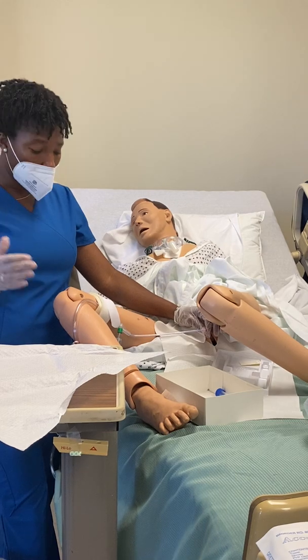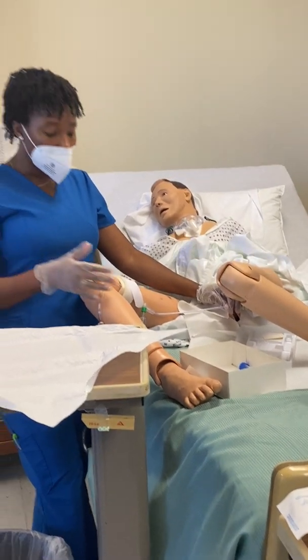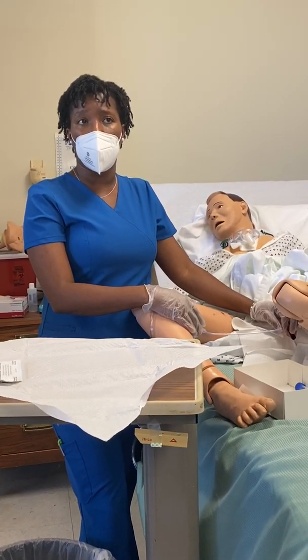But if you go flopping around because you're so glad, because you feel like you didn't make any mistakes, and you don't inflate that bulb, guess what? That catheter is gonna follow you right back out, and you just defeated your whole purpose.